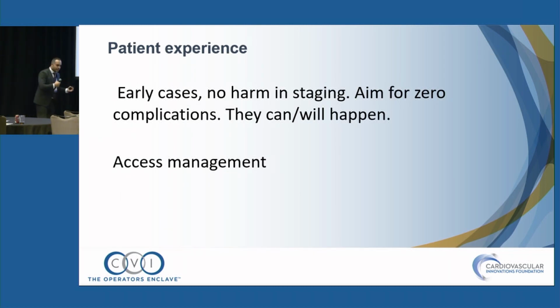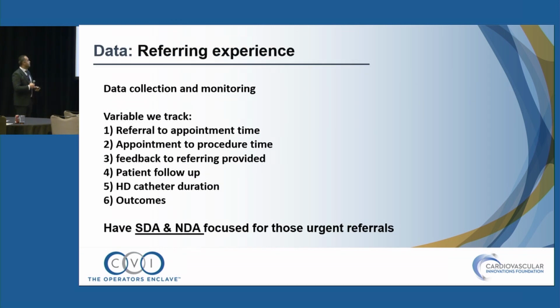So in the early cases, don't be as aggressive. The goal is not to have any harm. Aim for zero complications. They can and they will happen. Access site management is key. I still pull my own sheath and put on my TR bands.